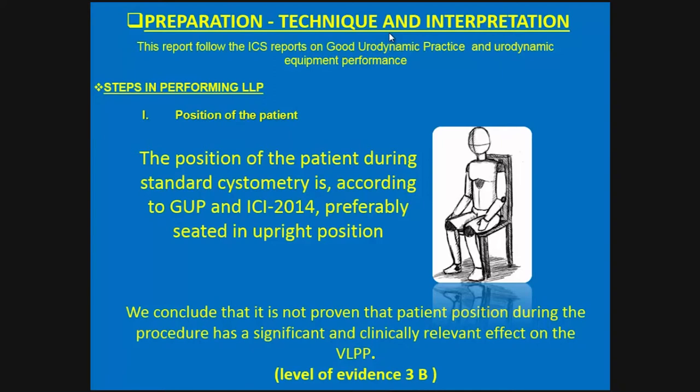We do know that there are conflicting reports on this, but we conclude that it is not proven that patient position during the procedure has a significant or clinically relevant effect on the Valsalva leak point pressure, with a level of evidence of 3B.